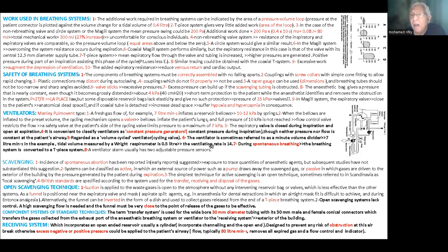Of course, it's adjusted so that it will not reach the full pressure, which was 10 to 12 kilopascal, to the patient. We can control all this by special valves.